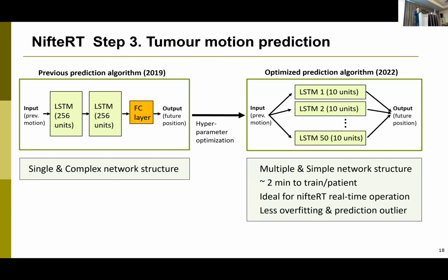So we're taking the median value, right? Input is the same. Because this was a lot simpler and we were able to train everything in parallel, it's the same network structure. It only took about a couple of minutes to train per patient. So this opened up a new area of research for us, because before we always thought that we were going to do the training before the actual treatment day. But now, because it's so fast, maybe we can train it right before we beam on, right?